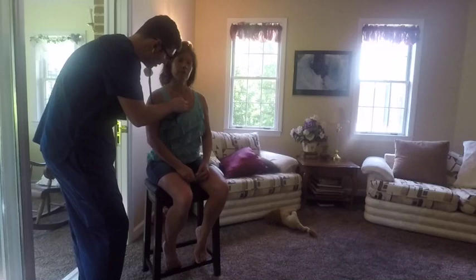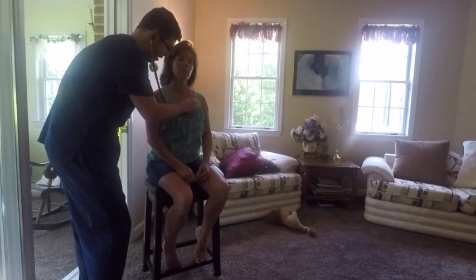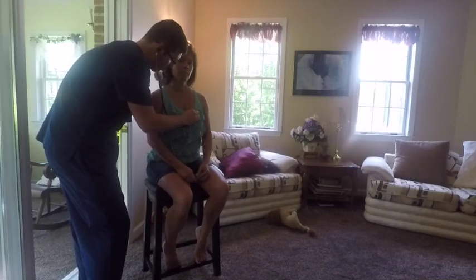space. And this is where you will hear the aortic valve. And now I'm going to move over to the second intercostal space on the left sternal border. And this is where you will hear the pulmonic valve. I'm going to move down to the Erb's point.